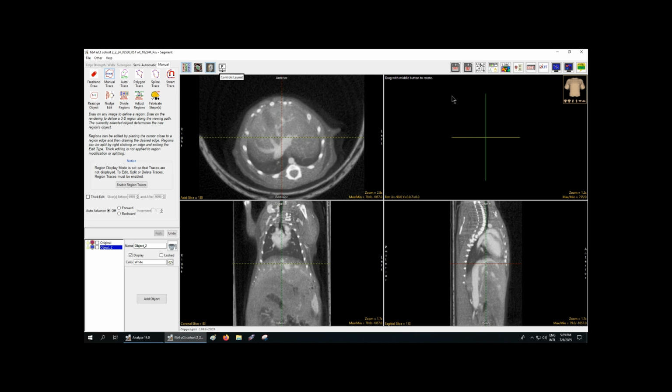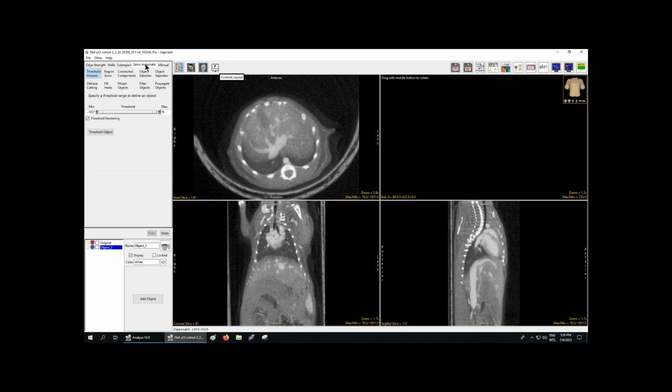Furthermore, here in your right top corner, you can select a toggle cursor link, which allows you to sometimes get a better look at the scan itself with no lines interfering with it. Furthermore, you have the object save options as well as the object save as options. And now we'll actually be going into the segmentation.